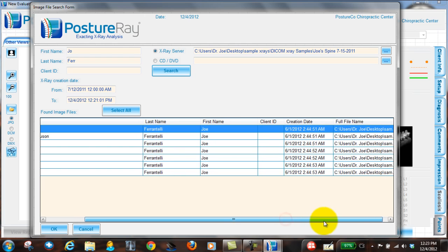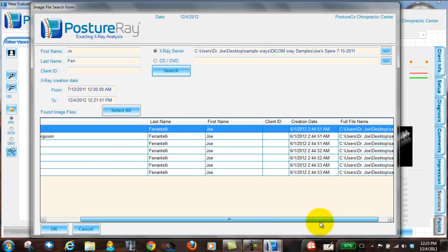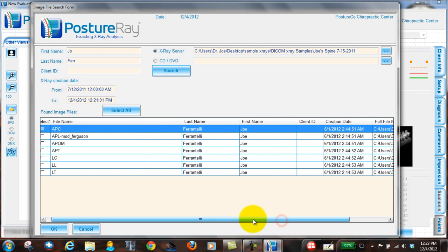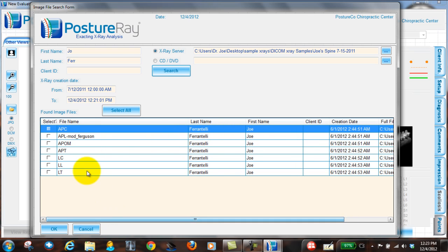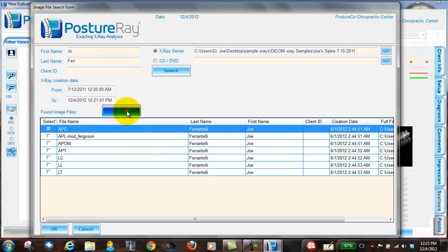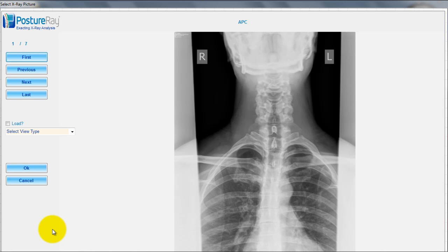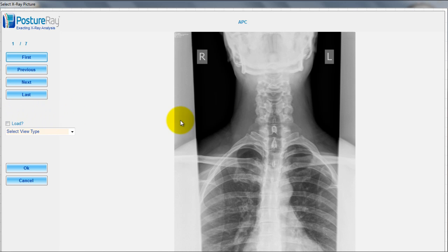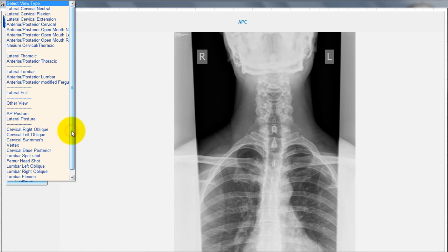Now, depending on what X-ray machine you have, it's going to usually tell you the creation date that the CD was burned or saved, tell you the first and last name. It may tell you the X-ray views. A lot of times it won't. It'll just tell you a path because many X-ray machines just give you like a long string of numbers. We just hit select all and we hit okay. Now, importing these images, sometimes you'll have a ability to do different grayscales and I'll show you that in just a second.